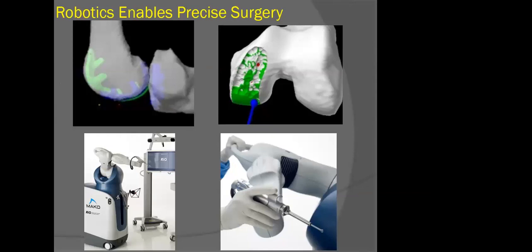So why robotics? Well, in orthopedics, there's been an evolution over the last 40 years in knee and hip arthroplasty to provide tools to the surgical team to best reestablish the new joint surfaces. Again, these are complex 3-dimensional structures with complex joint mechanics, and with better imaging and better data regarding the patient's innate natural joint mechanics, we can better reestablish those articular surfaces to best resemble and best replicate the normal mechanics of that joint. That allows for not only better short-term and intermediate function and optimal physiology, but also allows for longer lasting joint replacement applications.